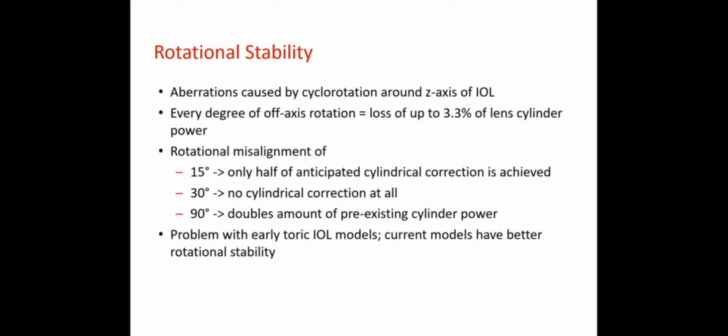Previously, when you are just looking at traditional keratometry readings, it's a little bit of a guess. If they're looking at the K values from a traditional keratometer, they need to mentally add in some posterior cornea astigmatism. For example, if you're looking at against-the-rule astigmatism from the keratometry readings, they need to add in a little bit more astigmatism, because we know that the PCA is going to be against the rule as well.